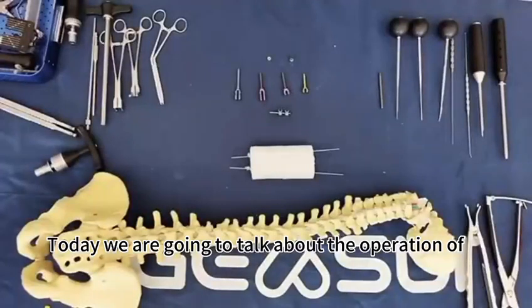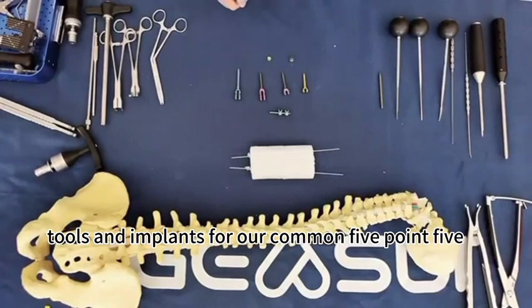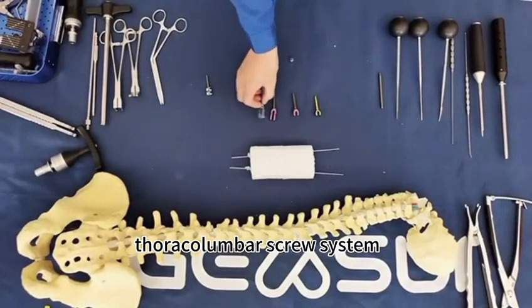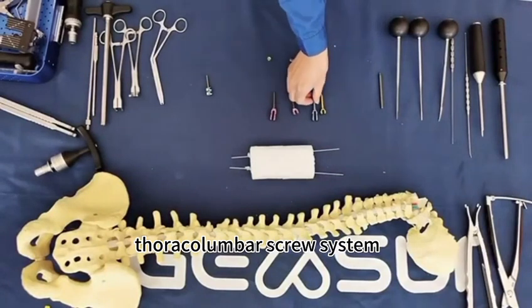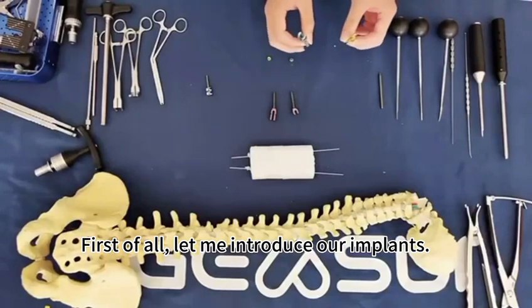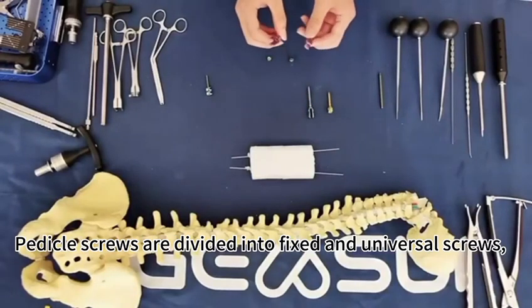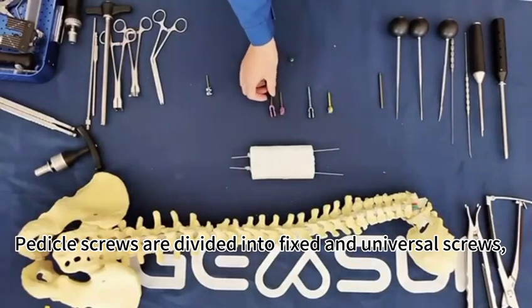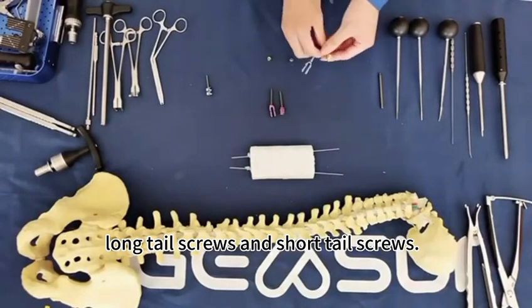Today we are going to talk about the operation of tools and implants for our common 5.5 Thoracolumbar screw system. First of all, let me introduce our implants. Pedicle screws are divided into fixed and universal screws, long tail screws and short tail screws.